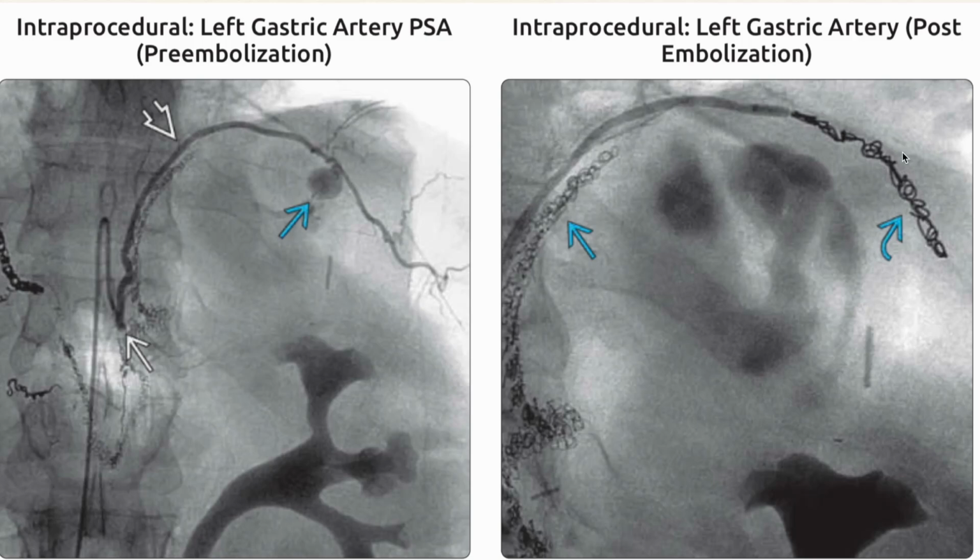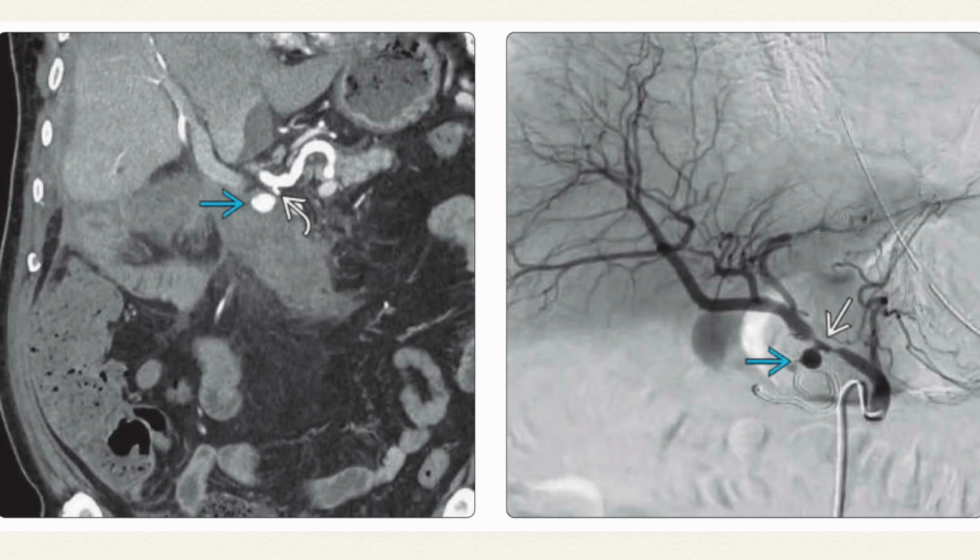But why so? Why do you have to sandwich all these arteries? The reason is, suppose you only coil distally, then the aneurysm will fill proximally. Suppose you only coil proximally, then the aneurysm through some collaterals will fill, and again the aneurysm will burst. So you should always block it distally, at the neck, and proximally also. So that same thing is done. You can see the amount of coils that is deployed, that has resulted in complete occlusion of the aneurysm.